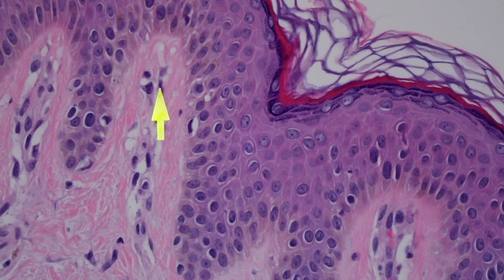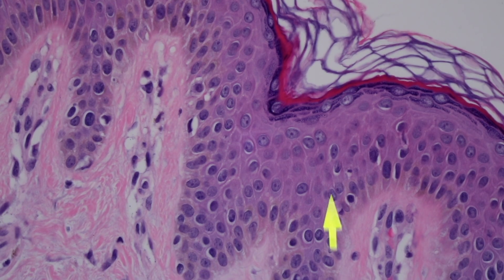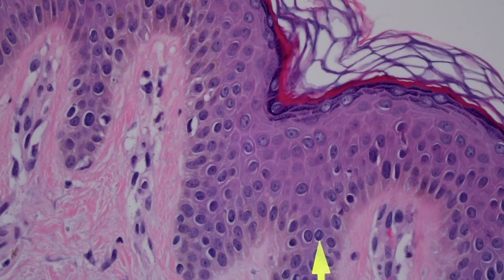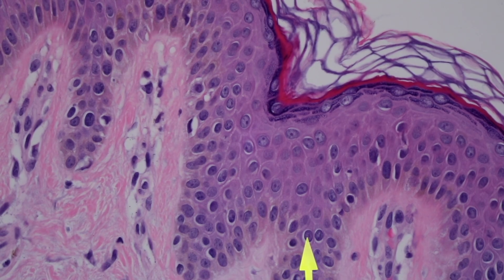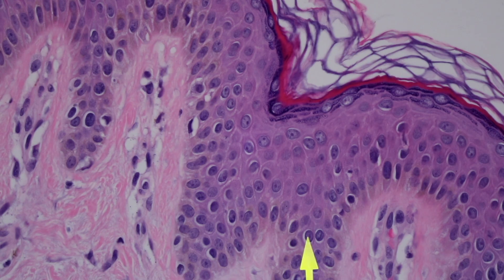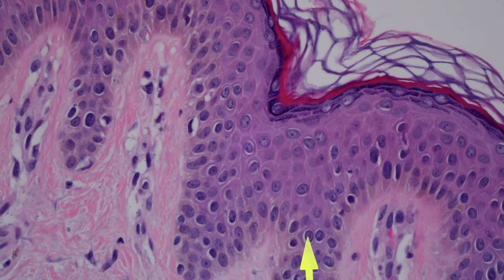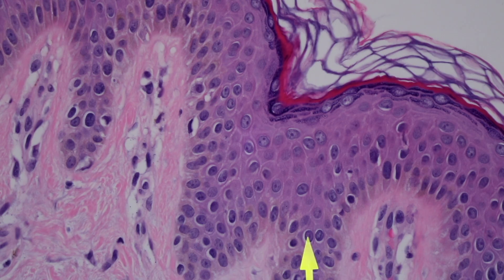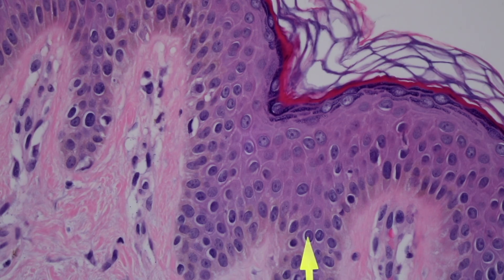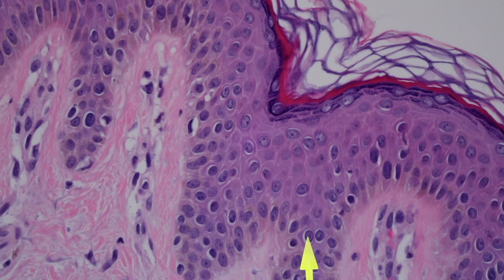Melanocytes are not hooked up to their neighbors. In contrast, look at these keratinocyte nuclei over here - they actually have that little halo, a little vacuole around the nucleus. The nucleus is kind of naked, floating in the middle of that little space. That's because when they shrink, all of their cytoplasm is hooked up to the desmosomes at the outside of the cell and can't go anywhere, so the poor little nucleus shrinks up and is naked and alone.